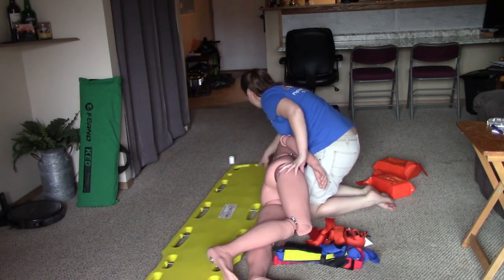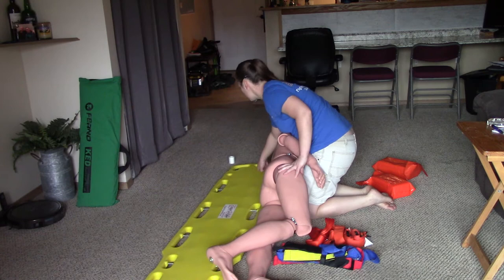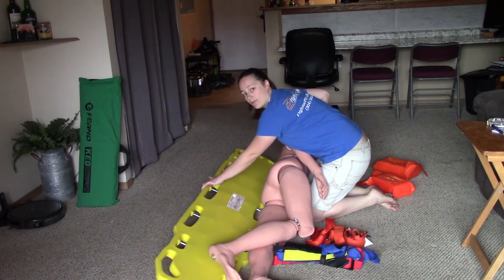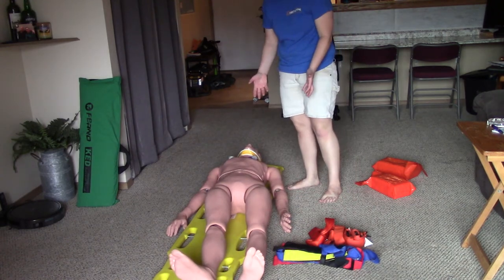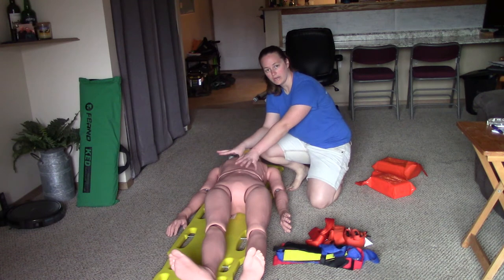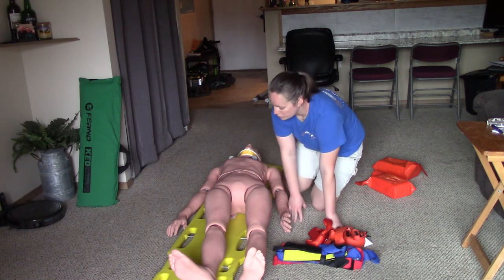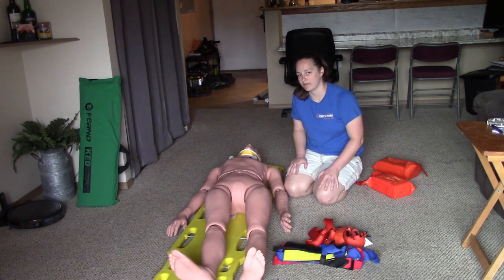We're going to log roll our patient onto the backboard. Once you get your patient onto the backboard, you want their head just below the hole at the top of the backboard. One thing that helps is making sure the board is snug under the patient, and tilting it up as you push your patient onto it — log roll back down on three: one, two, three. The patient may be a little lopsided on the backboard, so we'll do what's called the long axis drag to center them.